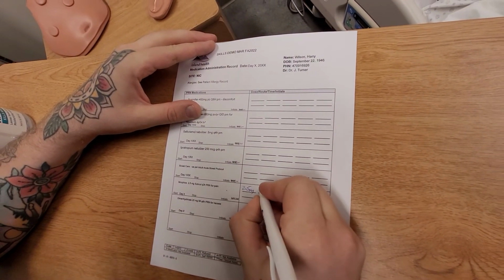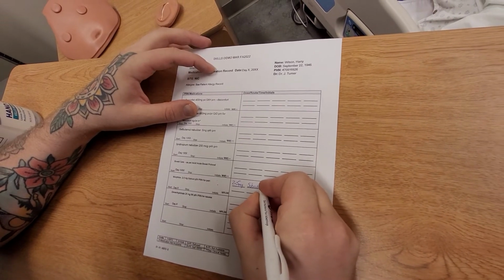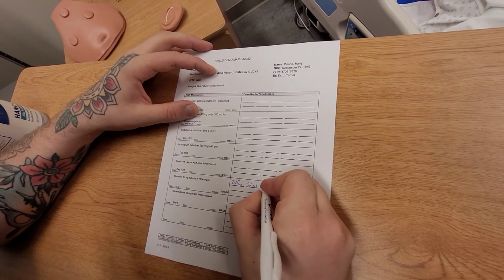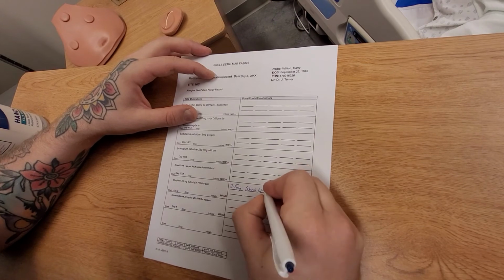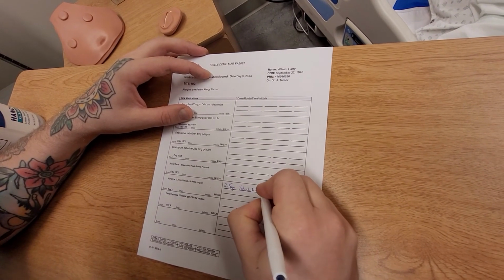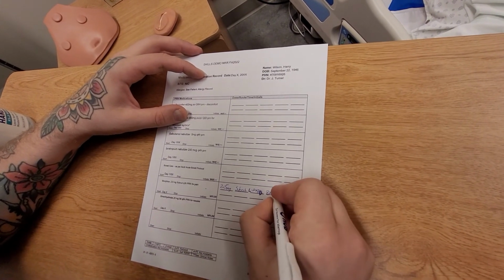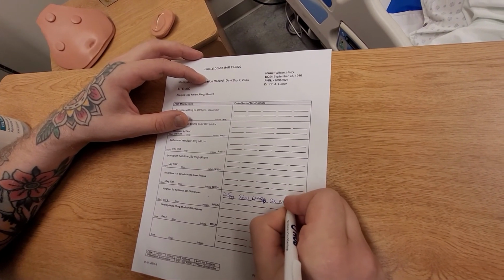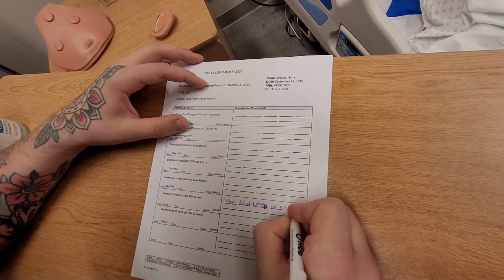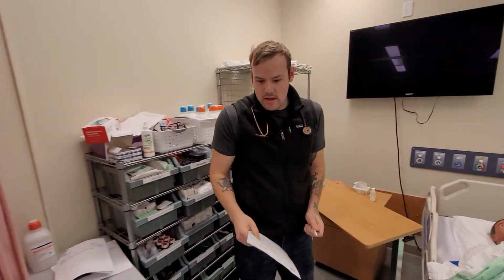We've given subcut in the left upper abdomen, and I'm going to put my initial on here, so it's BK NIC BSN. Alrighty, I think that's good.